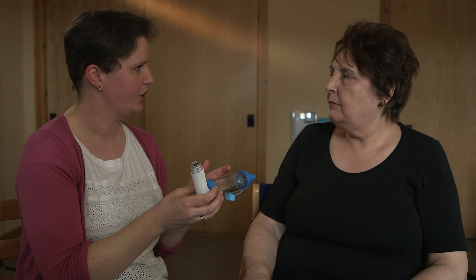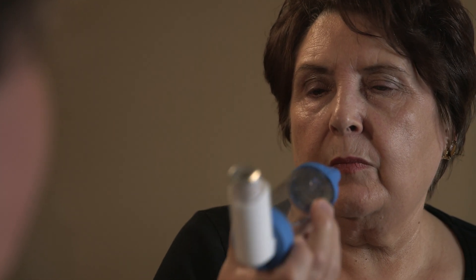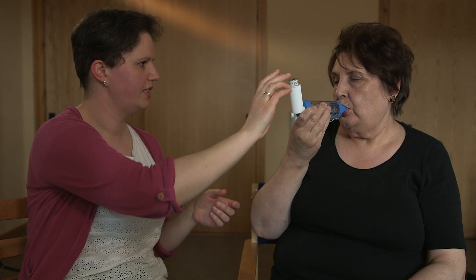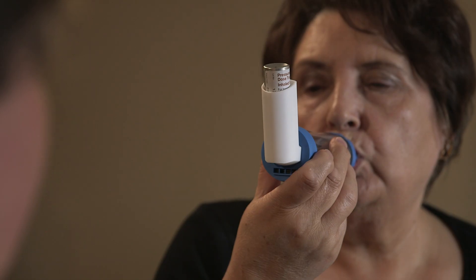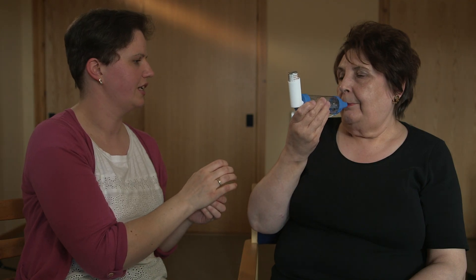Then I want you to hold your breath for as long as you can and then breathe out. So if I give that to you, I want you to breathe out first, put the spacer into your mouth, start to take a deep breath in. I'll press down on this. Take a nice deep breath in for me.